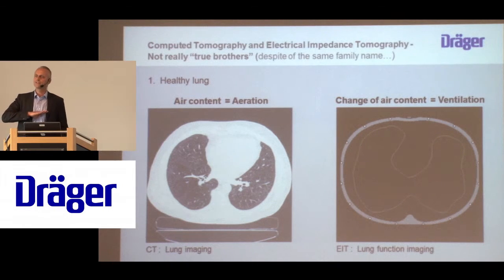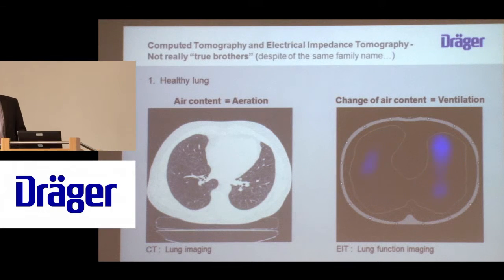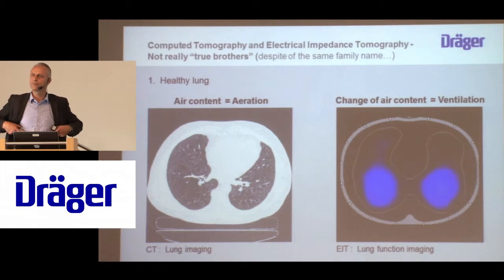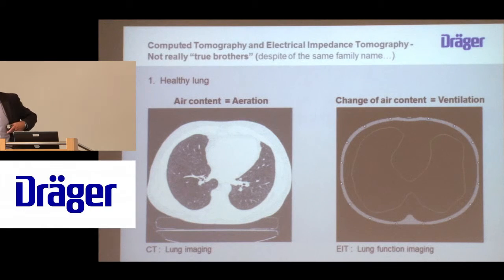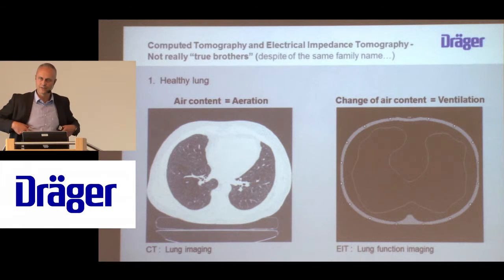Typically, one single CT scan represents 2 to 10 millimeters of slice thickness, depending on the setting of the CT scanner. With EIT, we are rather capturing a lens-shaped volume at the surface of the body, defined by the dimension of the electrodes. In our system, we are using a belt with a thickness of 4 centimeters, so the slice we are capturing is at least 4 centimeters.